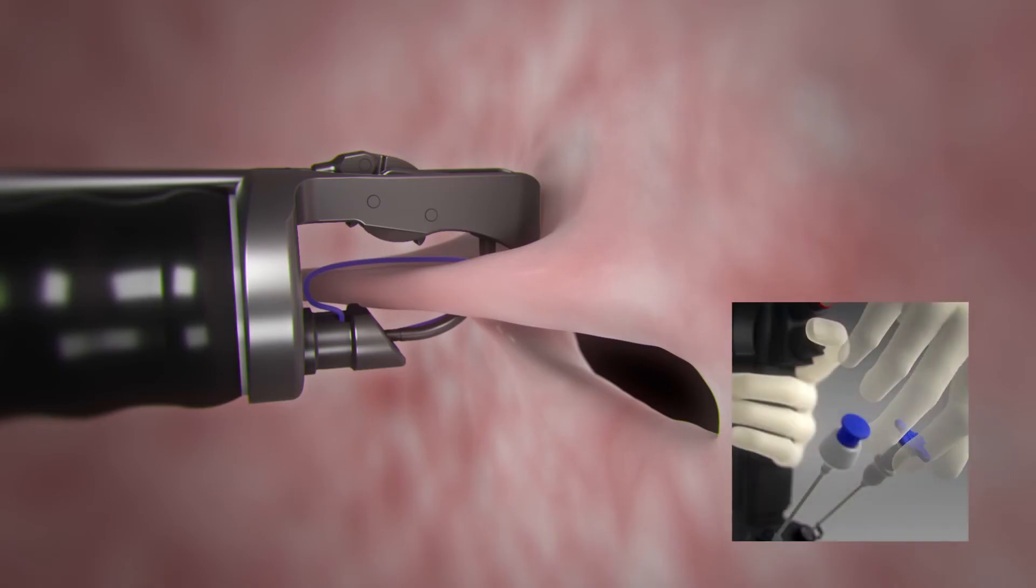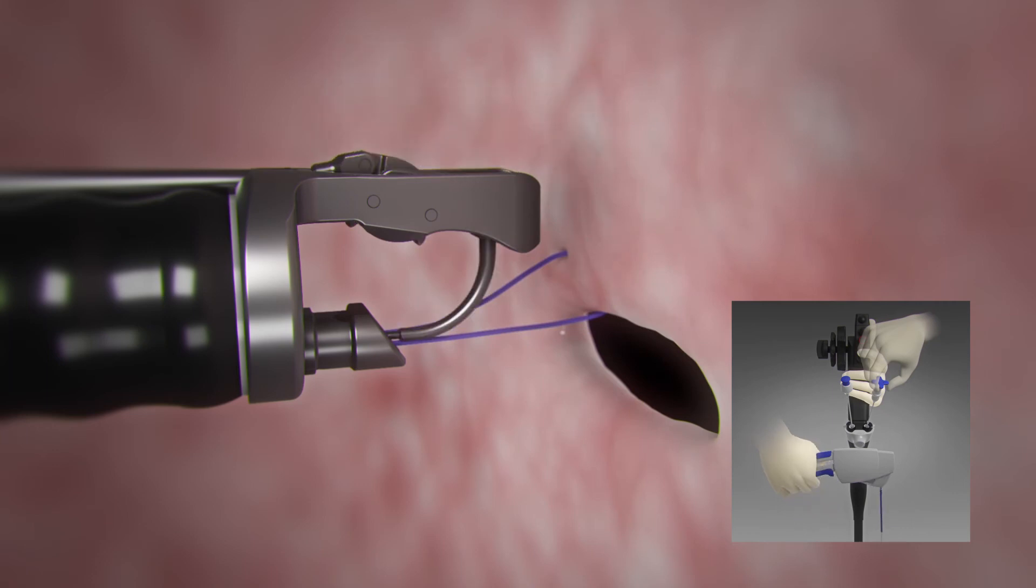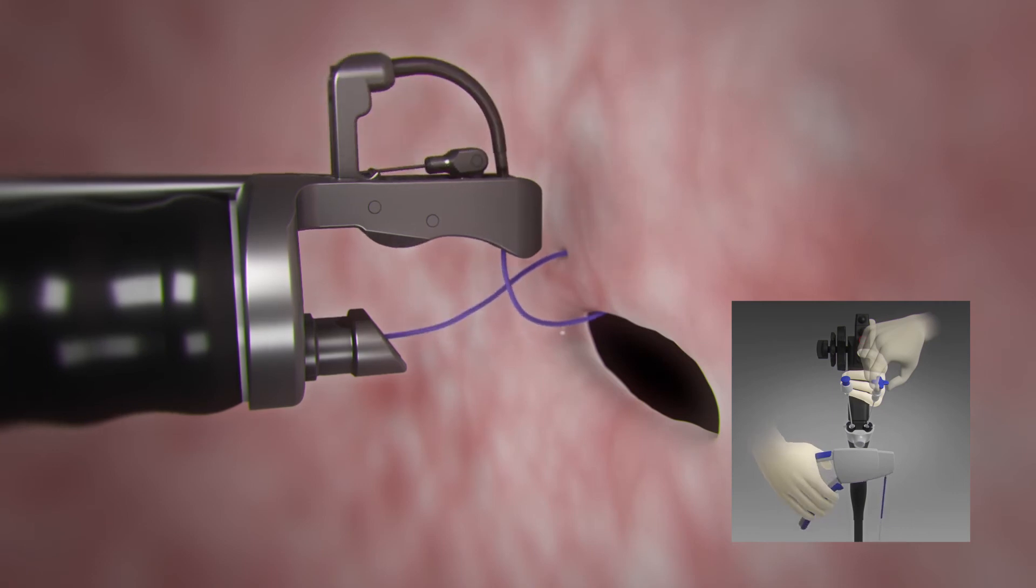Turn the tissue helix counterclockwise to release from the tissue and pull the blue knob to retract helix. Finally, open the needle driver handle. Repeat steps for additional full thickness suture placement.